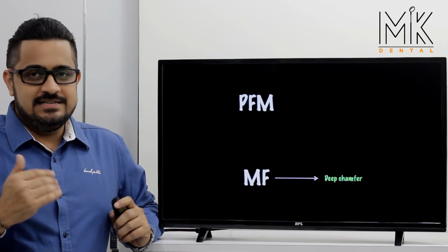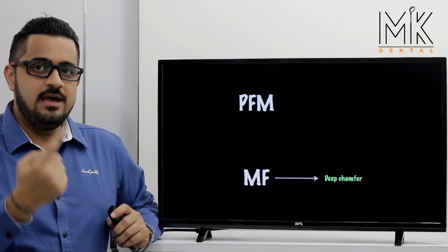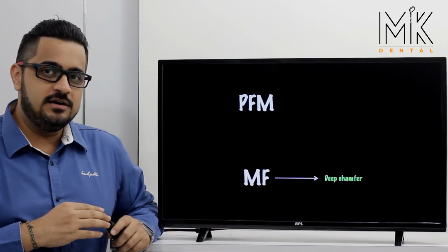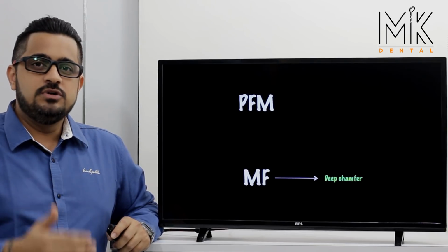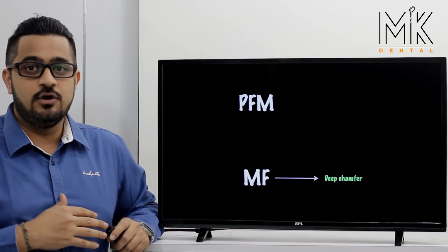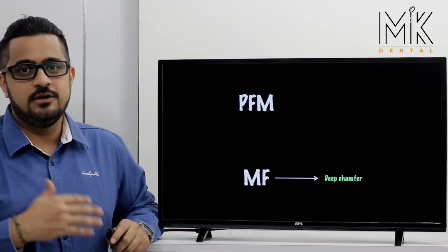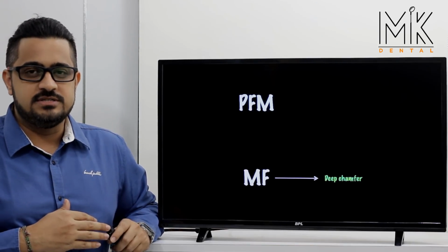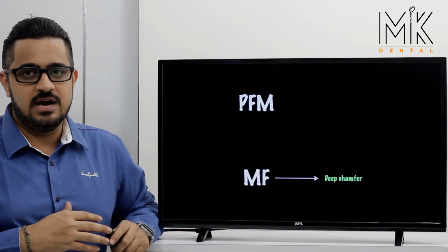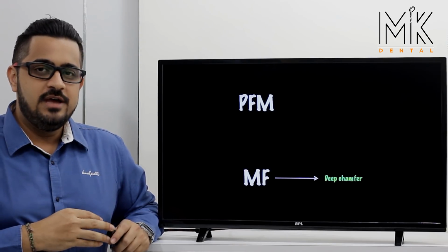What this means essentially, friends, is that in dentistry as of today, we only and only can survive if we know how to prepare two different margins. One is a modified shoulder, one is a deep chamfer. The other margins that we may have learned during our schooling, friends, are no longer practiced as of today because a lot of these margins were designed for gold-based restorations. And unfortunately, we clinicians do not have gold at our disposal for our patients. Friends, I hope this short little video helped you understand the concept of margin architecture and how that is dependent on the prosthesis that you choose.